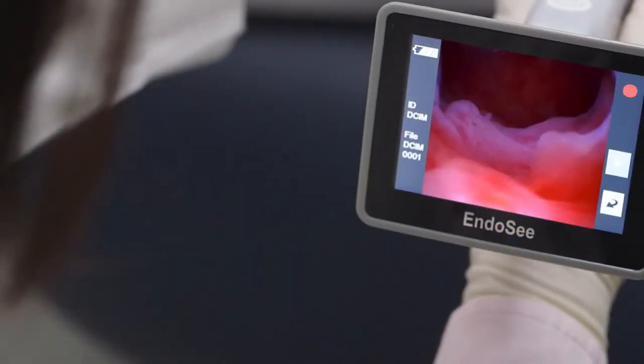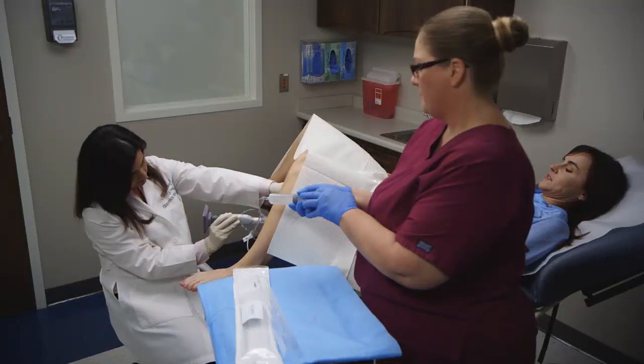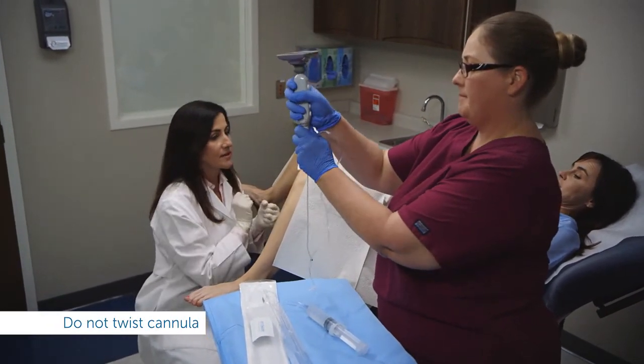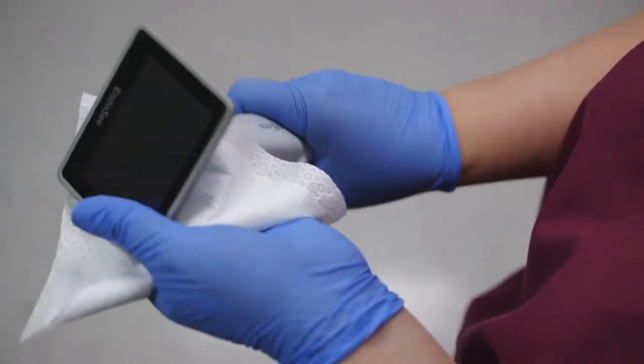To stop recording, press the camera button one more time. Once the procedure is complete, press the power button to turn the system off. Keep the handset vertical with the cannula directed down so fluid doesn't drip onto the handset. Without twisting, remove the cannula by pulling straight out and dispose of it. Then disinfect the handset.